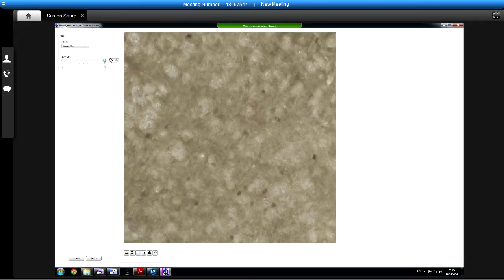Because this is very brown, you don't see the effect of the noise removal very much, to be honest. So what I'm going to try for now is the first one, which just softens it slightly, with just a few clicks of that. We can always jump back and forward, change it, and see the effect of it anyway.